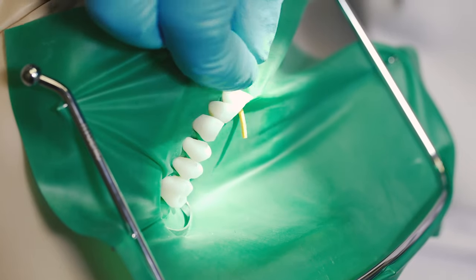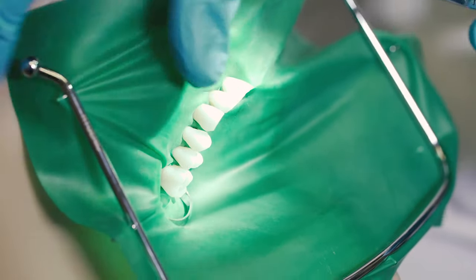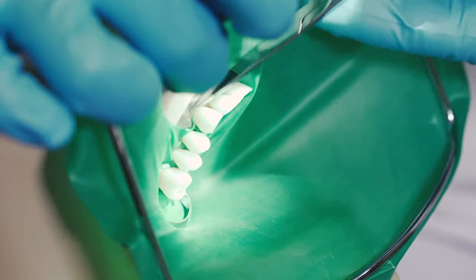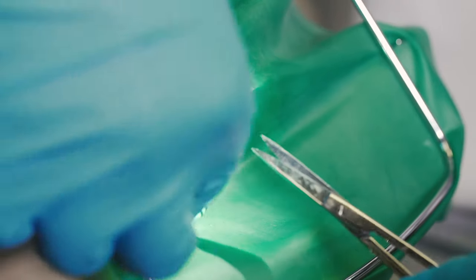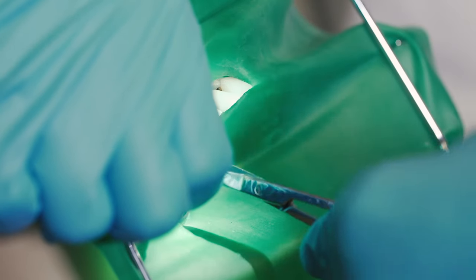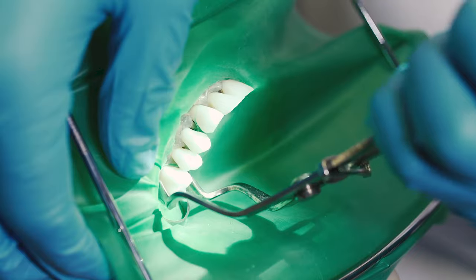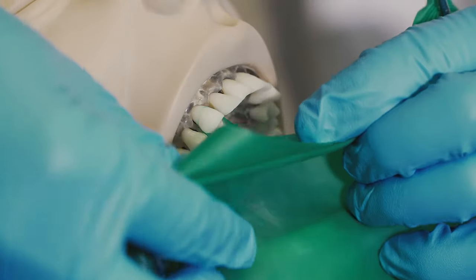To remove the rubber dam, we're first going to pull the wedget out of its place. Now, using a straight scissor, we're going to cut the septum between each of the perforations, stretching the rubber dam buccally. Then you go ahead and remove the clamp from the abutment tooth, and then you can go ahead and easily remove the rubber dam from the patient's mouth.